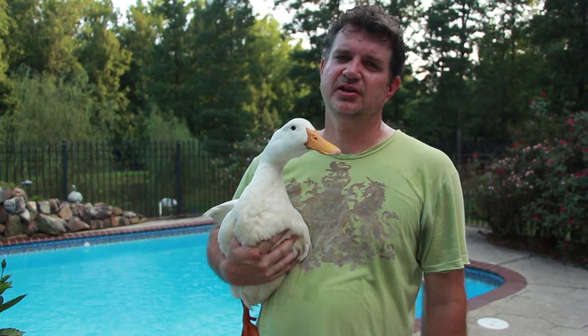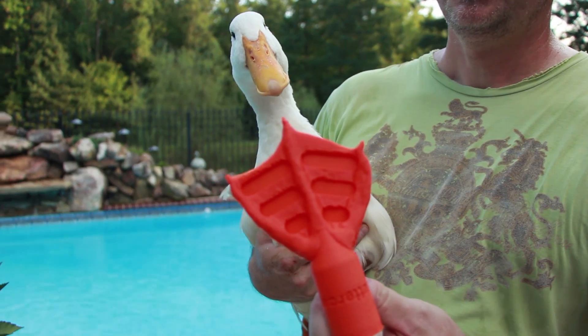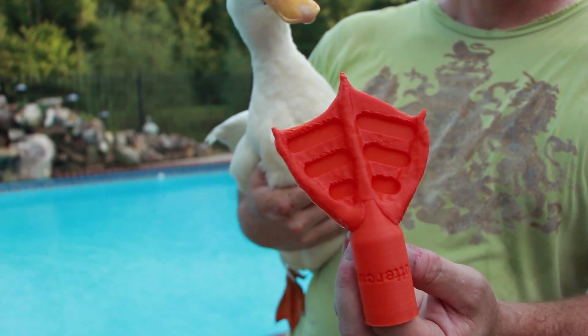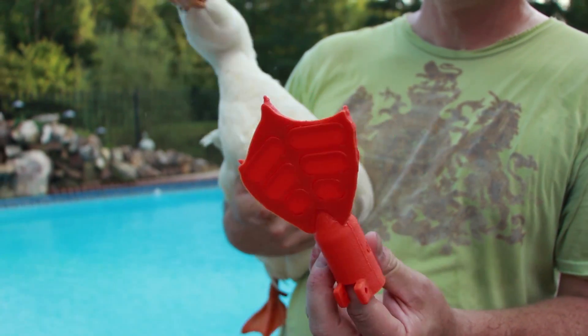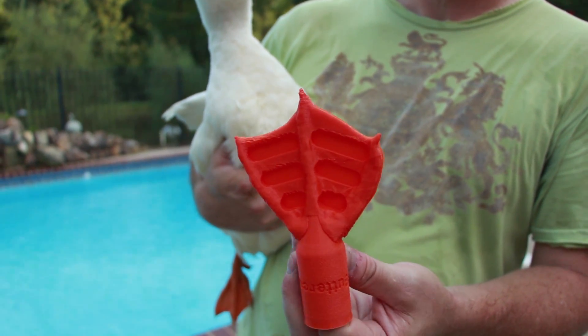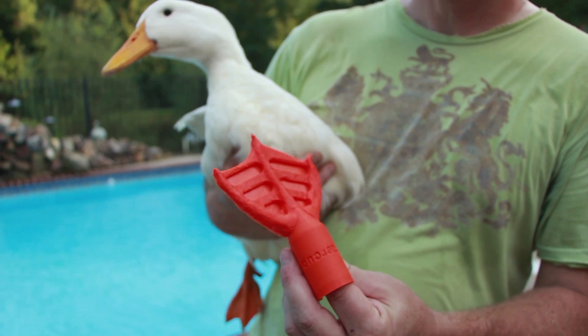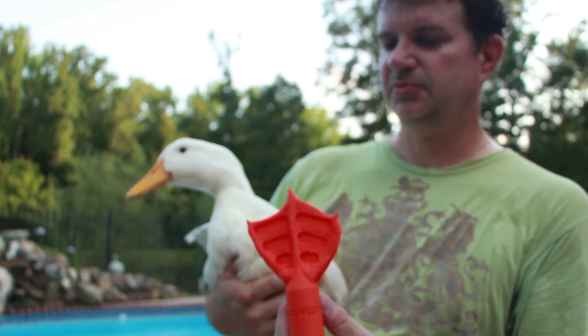So I came up with the idea of inventing him a swim foot that he can wear. This is what we came up with — a modification of his foot to be straight, and if you look at the back side, it has little flapper doors that open. So that when he swims, the water will pass through the front, but when he kicks, they'll close and be able to push the water. Buttercup's going to put the foot on, and you'll get to see him swim a little bit.